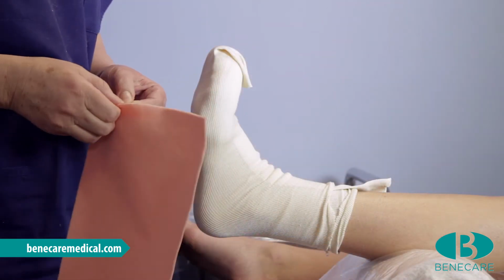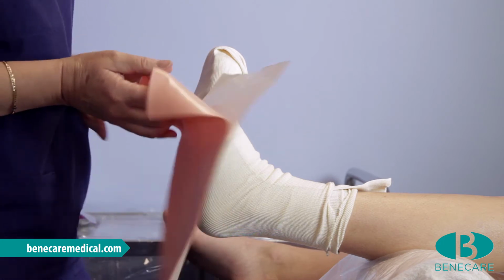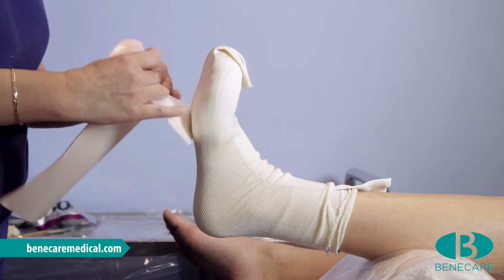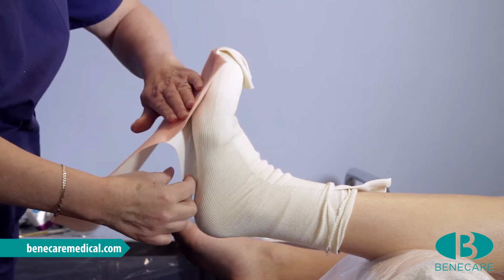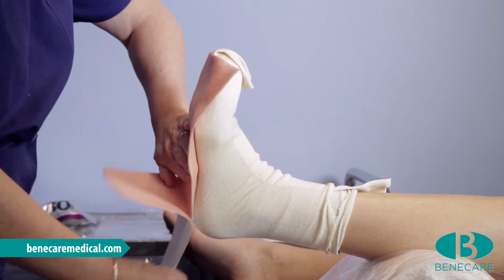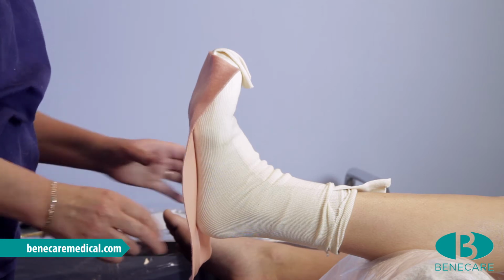I am now going to use a product called fleecy web. This will enhance patient comfort and prevent any strike-through of the resin. I will apply it to the whole of the plantar area of the foot. Start by positioning across the toes, removing the protective paper during the application.